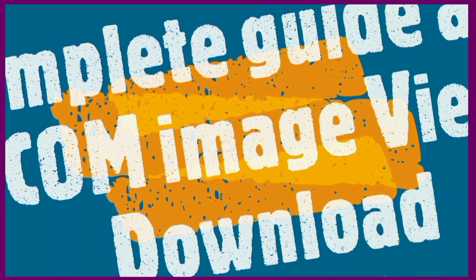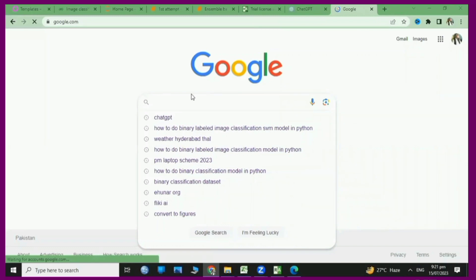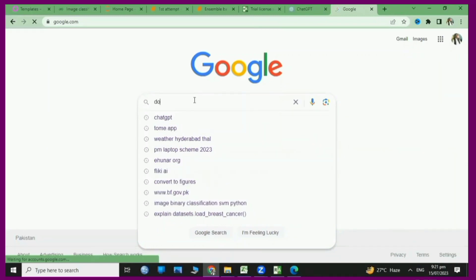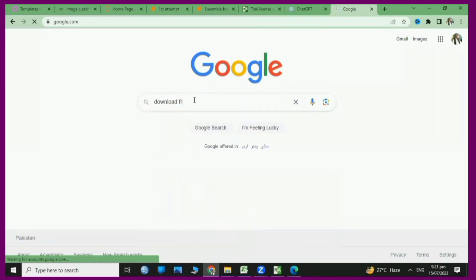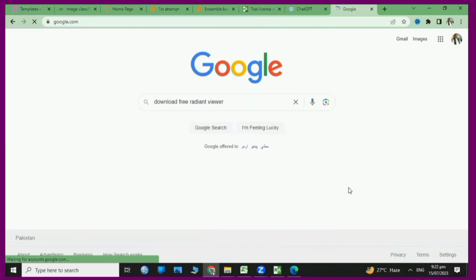Assalamu alaikum, hi everybody. In today's tutorial we will learn how to install a DICOM image viewer that is specially for medical imaging — to view, size, and print. Any type of medical images are converted into the DICOM standard, and DICOM type images can be viewed only by a DICOM image viewer.